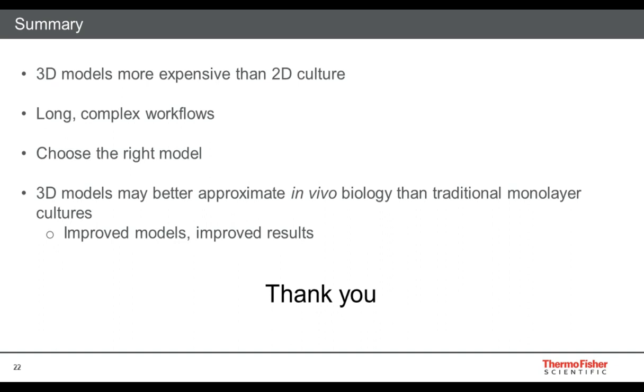So I know frequently people question how relevant of a material it is, given that the composition of the material can vary from lot to lot to the extent that it requires lot testing for one's experiments, so that they could then procure a relatively large amount from a same lot that functions for their needs, in order to be able to reproducibly generate their data. So these undefined or sometimes inconsistent components of these materials are certainly a limitation of it.